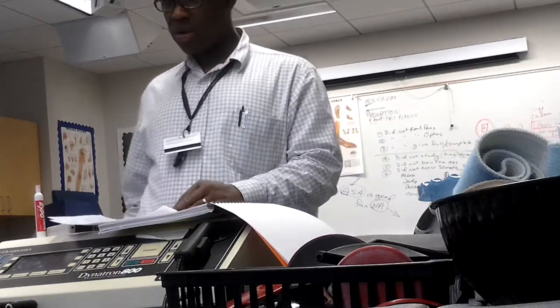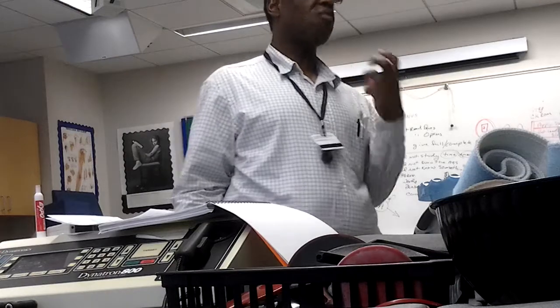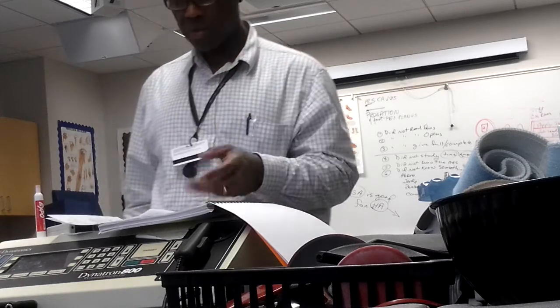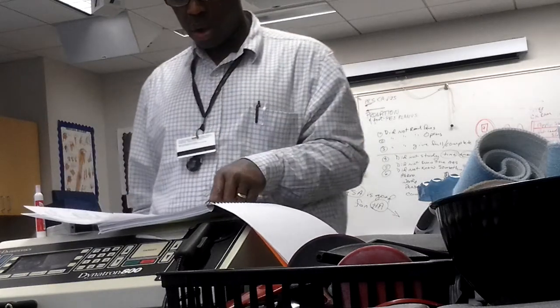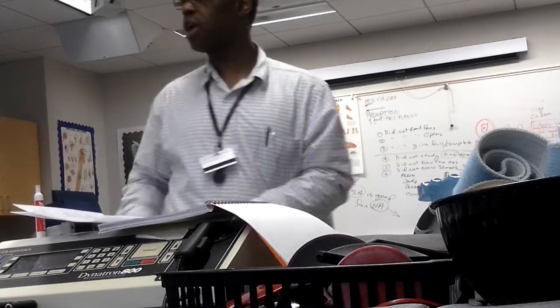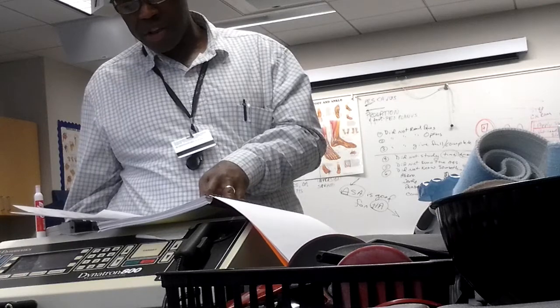All right, so this was a quiz question, and it said, other than putting the pads on top of or around an area, where else can I put it and still get an outcome for relief of pain? Okay, so if we look on page 3, the site of pain or around the pain is one area, but we don't want that. We want over the nerve roots, or the involved dermatomes along the course of a peripheral nerve, like the Hoku point. I'm treating the arm even though I have it on the Hoku point. Okay. Related motor and trigger acupressure points.